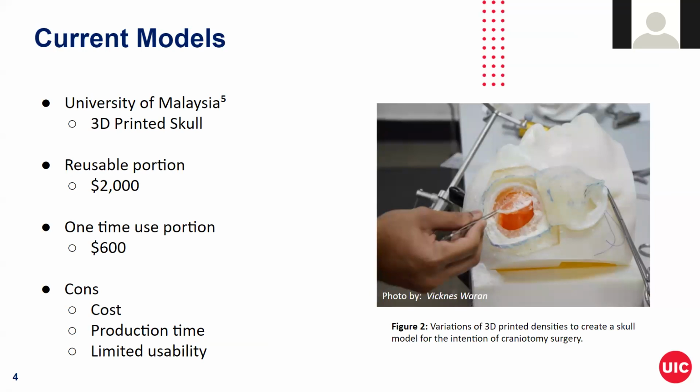Here is an example of an existing model. This was 3D printed from the University of Malaysia. Although they did a great job with their cranial model, there are some drawbacks such as cost of reproduction, time development, and limited usability.